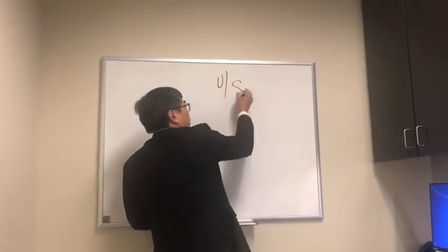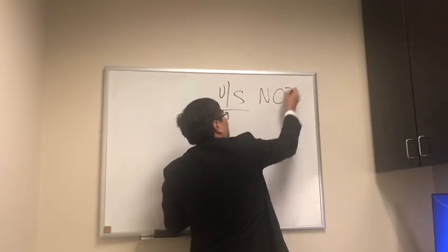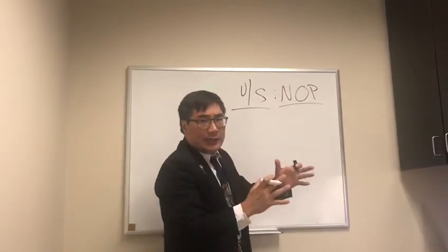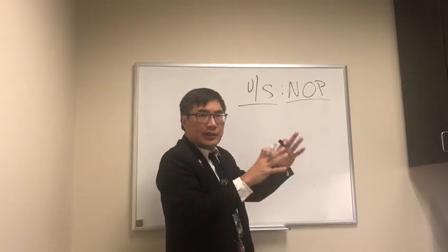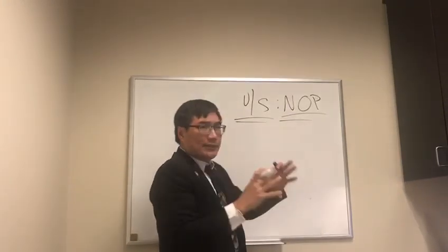So today we're just going to talk about how we use ultrasound, but not all ultrasound, just ultrasound for neuro-op. Ultrasound has a lot of utility in terms of intraocular tumors and looking for orbital disease. But in neuro-op, we really are using ultrasound in very defined ways.